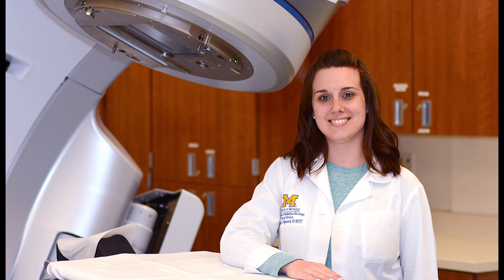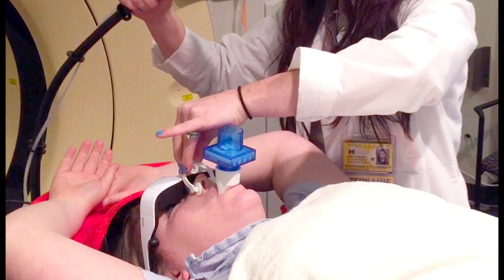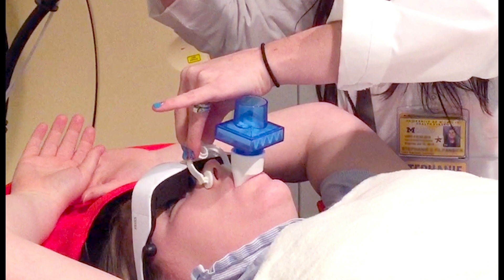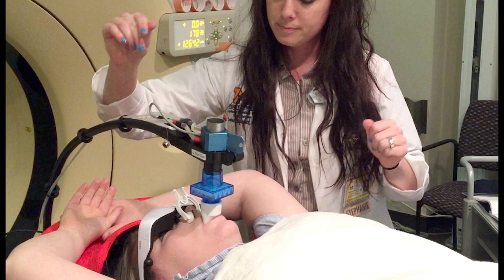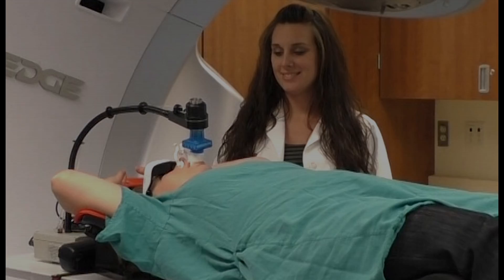Welcome to the University of Michigan Department of Radiation Oncology. This video is a brief introduction to the SDX voluntary breath hold device, which is one of several methods we use to limit movement throughout imaging and treatment. This voluntary breath hold method allows us to reproducibly position the tumor during imaging and every session of treatment, and therefore reduces irradiation of healthy tissue. The breath hold method is called voluntary because you remain in control at all times and can resume normal breathing whenever you wish. Your therapist will guide you throughout the process. This tutorial will show you what to expect.